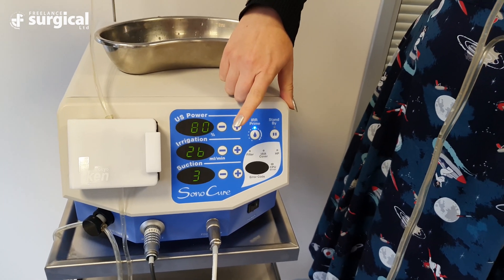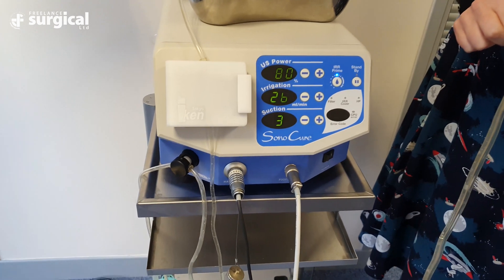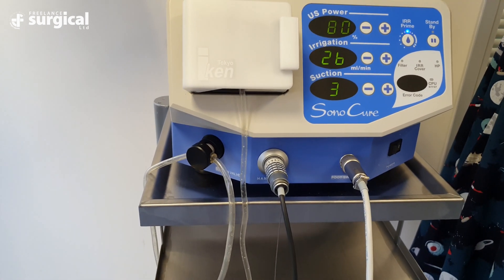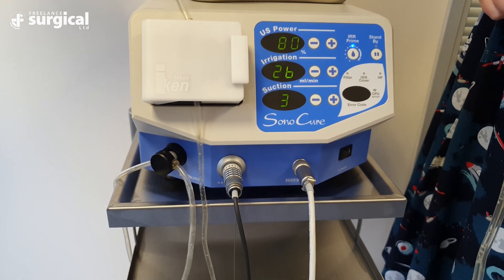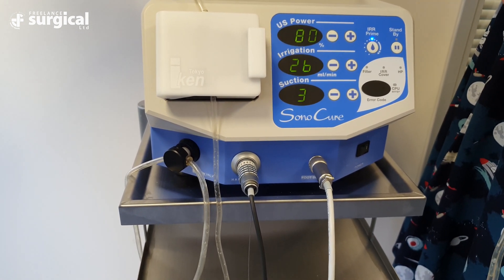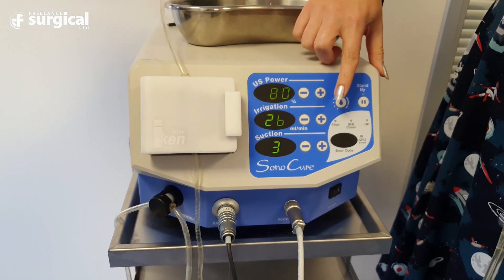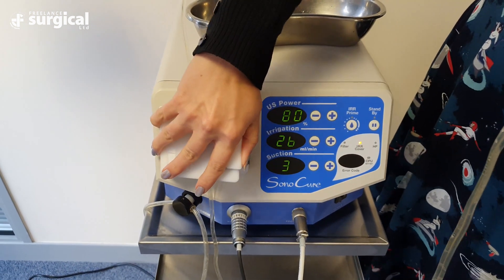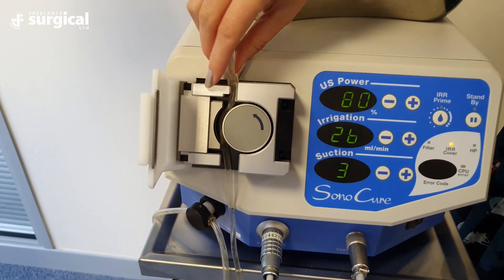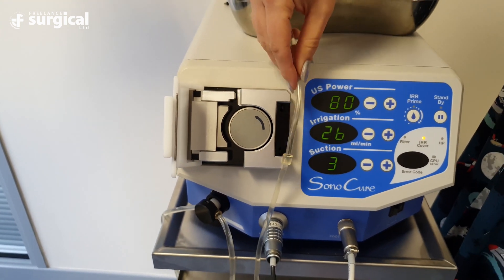Remove the generator from the standby mode by depressing the prime button. Ensure that there is sufficient saline in the fluid bag before priming the generator to remove any remaining blood or debris. Allow the saline fluid to run clear through the tube and into the suction canister. Once this is achieved, disconnect the fluid bag and remove the tubing from the peristaltic pump and the suction pump to remove any residual fluid.